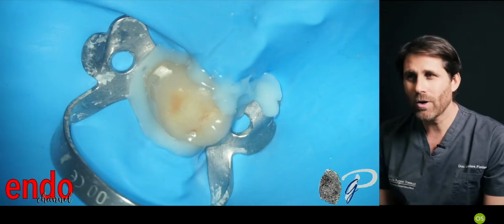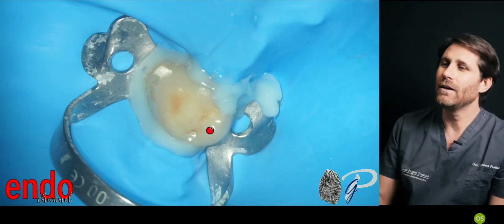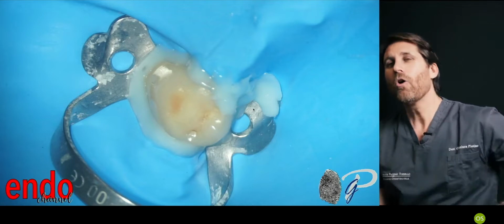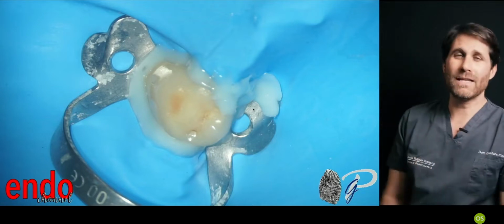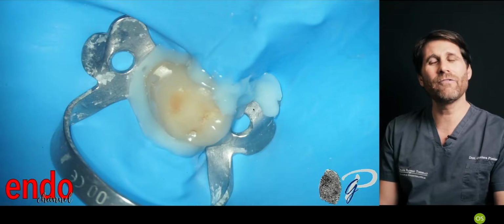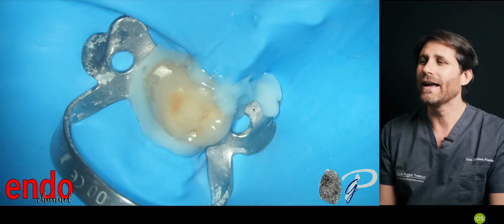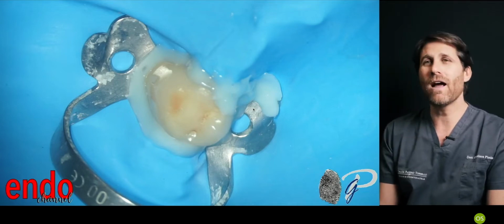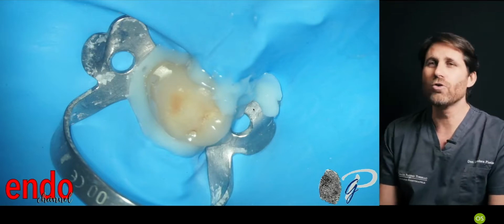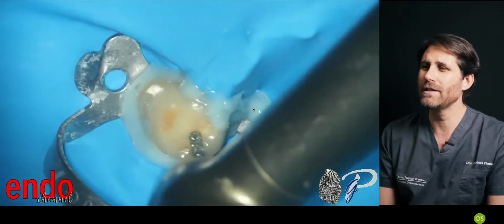I like to underline that isolation is always the starting point: rubber dam and a liquid dam to isolate the space perfectly. Then always use new burrs to perform this access, and control your high-speed handpiece, which should not have high vibration, because especially when you have ceramic on metal, like in this case, or ceramic on zirconium, ceramic tends to detach from the metal or the zirconium when you cut it. So you have to reduce the vibration and use new burrs in these cases to reduce the damage on the ceramic.